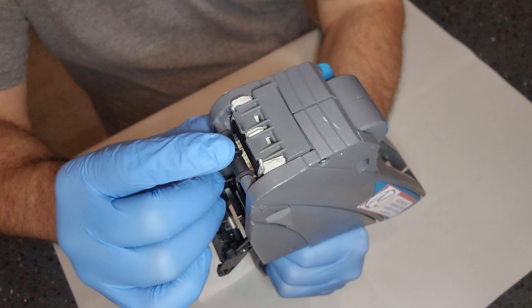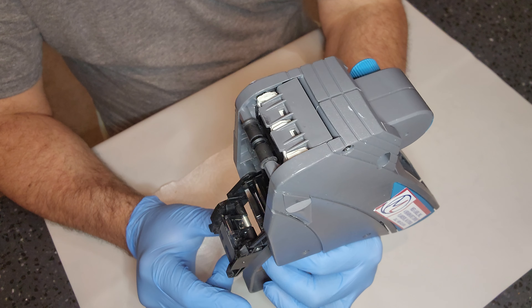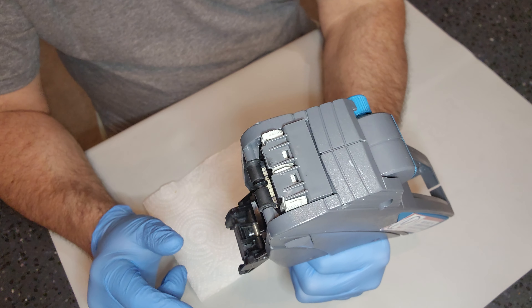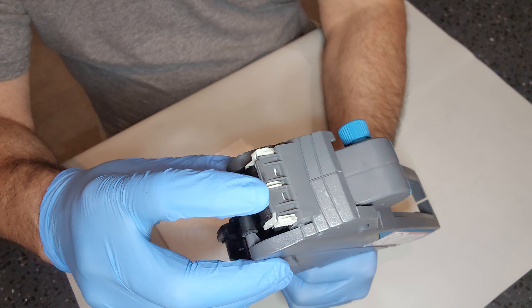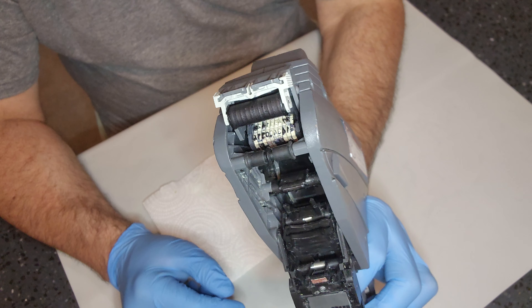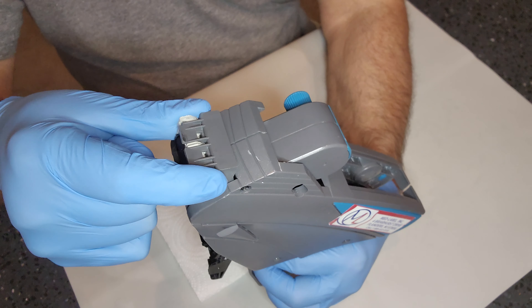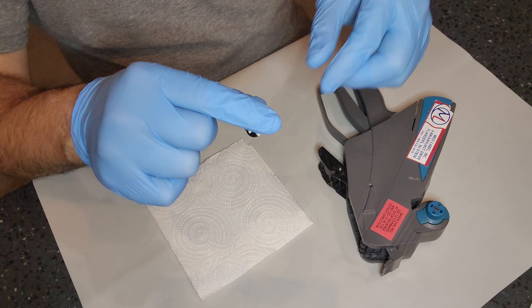Now, if you let go it's actually going to pop right back in, so keep squeezing the trigger and with your finger push that latch all the way up. That gives you access to the ink roll.